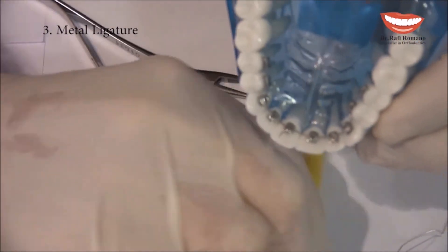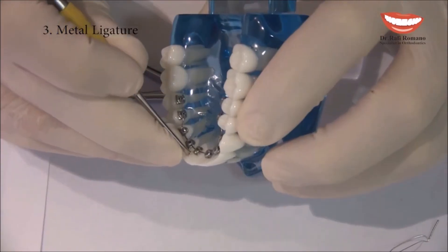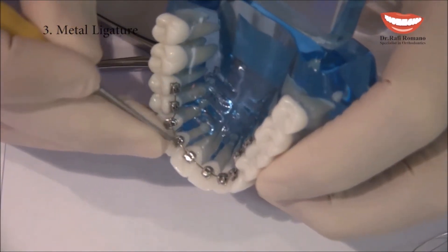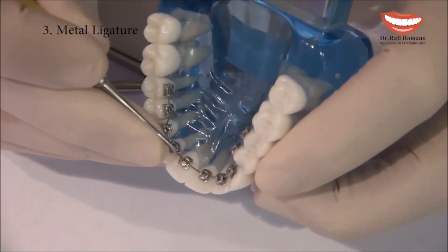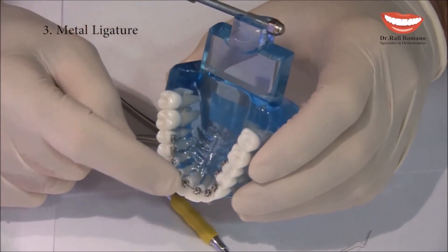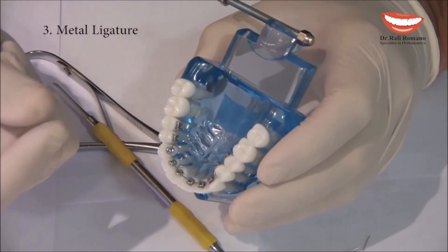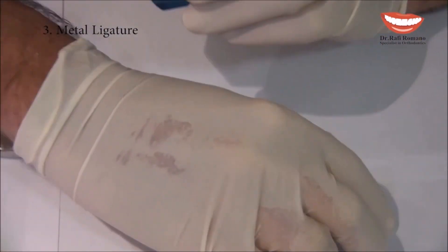Then I take the ligature director and bend the wire end under the archwire. I usually also use my hand to feel that there are no poking wires, because the tongue is very, very sensitive.